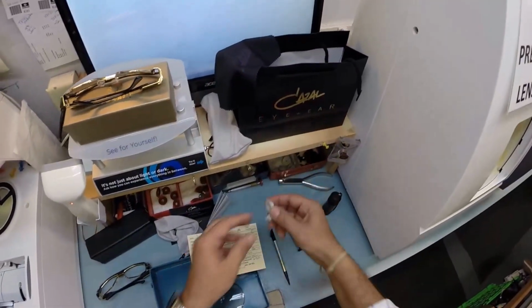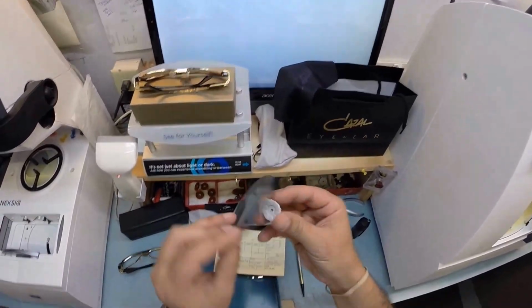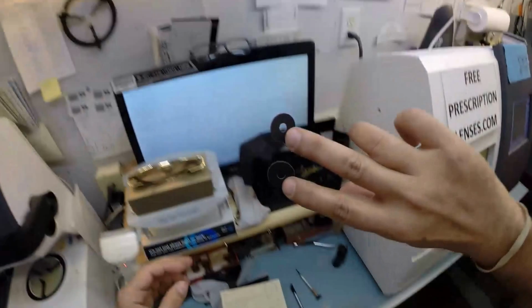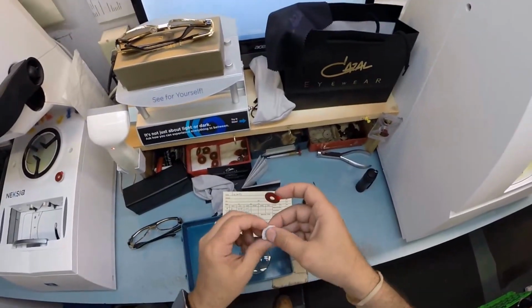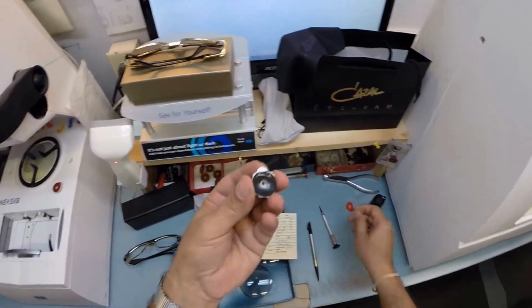So what I do with the lens, here it is. I need 2 blocks, or as I like to call them, Jenny from the block. I need to attach this to your lens while it is cutting. So I need 2 double-sided adhesive stickers, which I've got up here. The black side is the sticky side. I'm going to stick one onto the first block, and the second one on there. Pull away the paper to make the black side sticky.